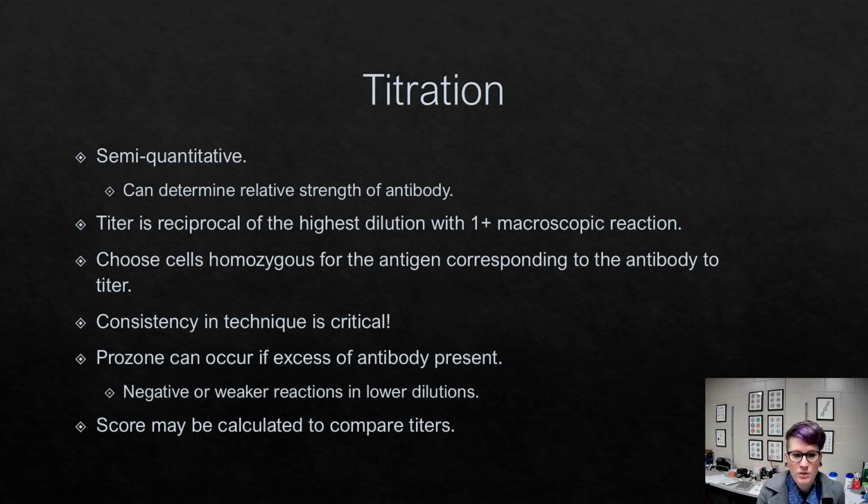Titration is considered semi-quantitative. It can determine the relative strength of an antibody, and the titer is reciprocal to the highest dilution with a 1+ macroscopic reaction. This is important because if you have a weak plus reaction, you're not going to consider that your last reaction. It has to be the 1+ reaction.